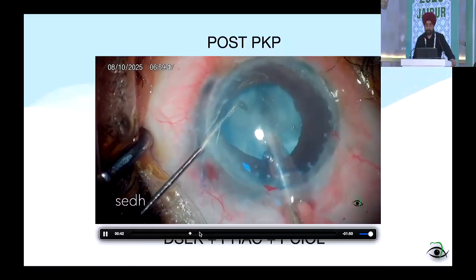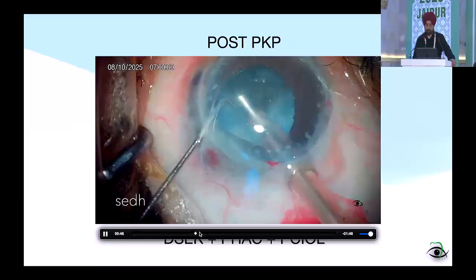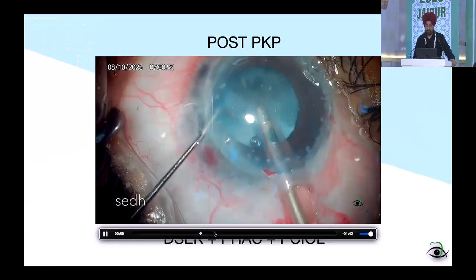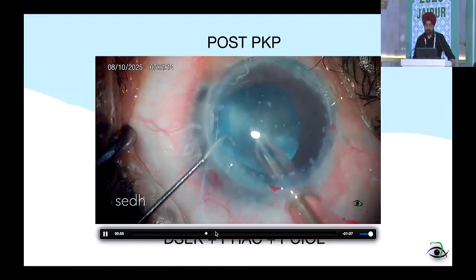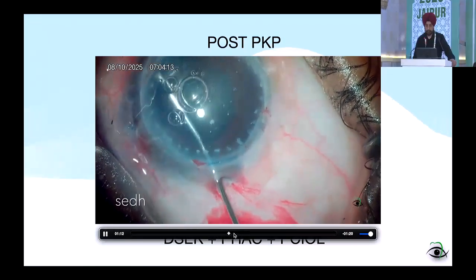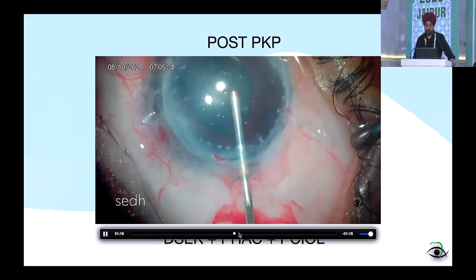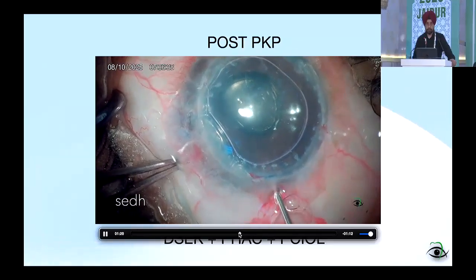capsular axis. Though this is very easy because of the steroid the patient has been using, the cortex is softer to be aspirated, taken by the phaco. You don't need much power, but we need to be careful because it's been an inflamed eye all through. Making the anterior chamber deep with the visco, and you put an air bubble to wash out the visco now.